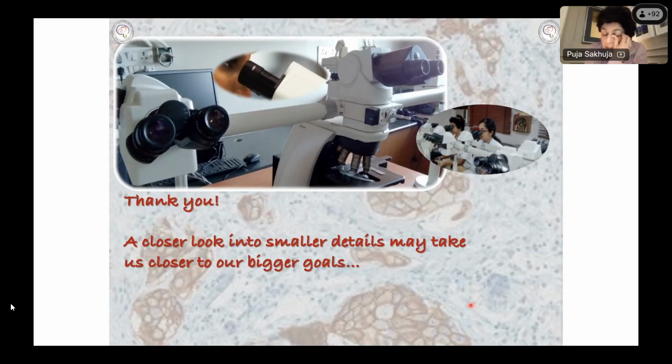In a duodenal biopsy, you would always comment on the nature of the villi and the IELs, and then whether or not an ulcer is present, and whether you can see any cause for the ulcer. Okay. Thank you, madam.